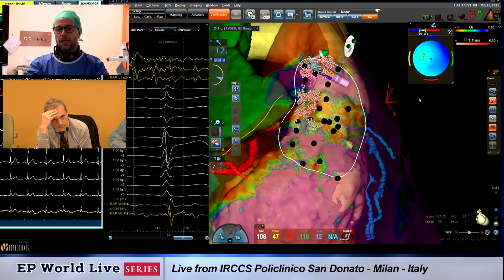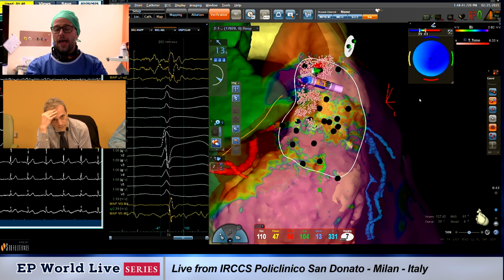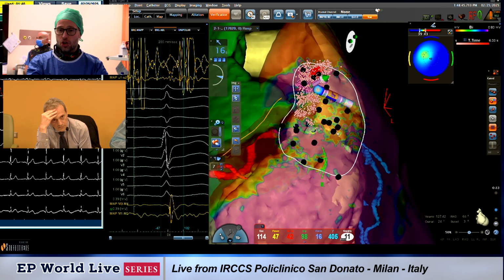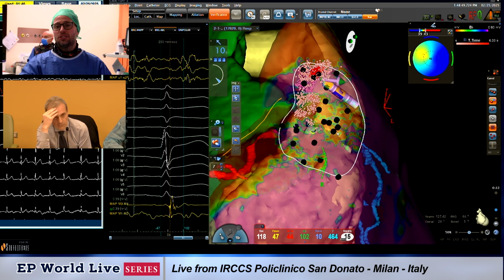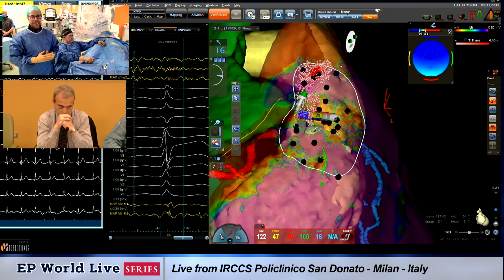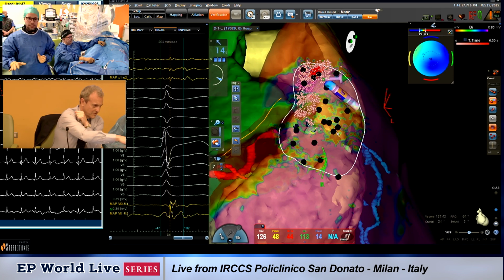This dynamicity is shown during a sodium channel blocker test, and only a minority of them may show lower voltage, but always this late activity, which is very delayed with a total duration of the signal, which is even beyond the 200 milliseconds. This is a completely different scenario.